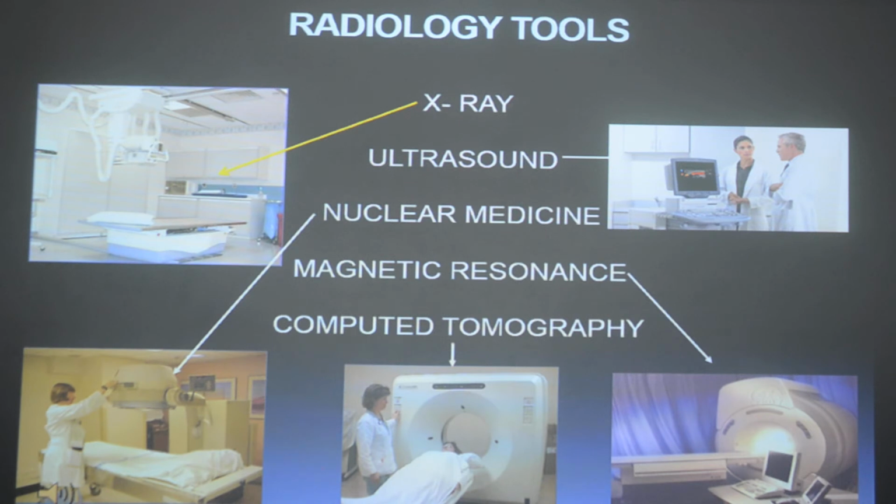Why do you need to do an invasive procedure when you have a non-invasive CT or an MR which is done within 5 seconds? Obviously, it makes sense.